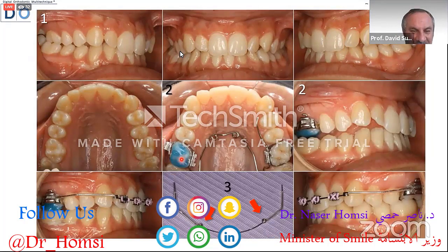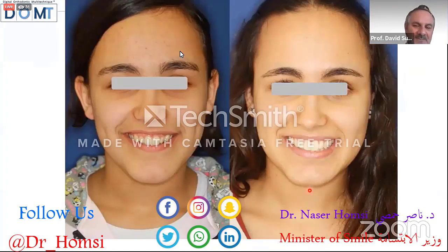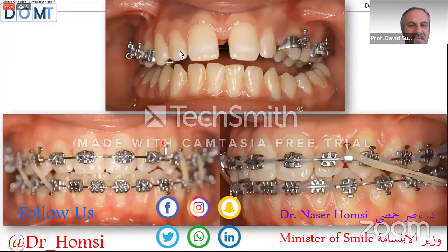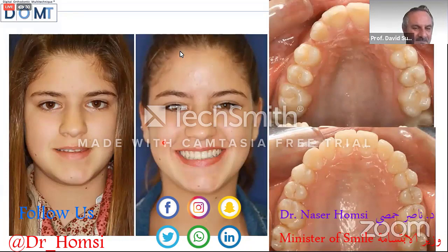We use the quad helix to expand this molar and to control the expansion with this type of bypass arch wire, and at the end of the treatment you can see the nice smile of the patient, because the patient presents a dental class 2. Even in patients with a collapse of the maxillary, with a problem in the maxillary, we are using rapid maxillary expansion, and a very good control after this rapid maxillary expansion, a very good negative control of the molars and the premolars.